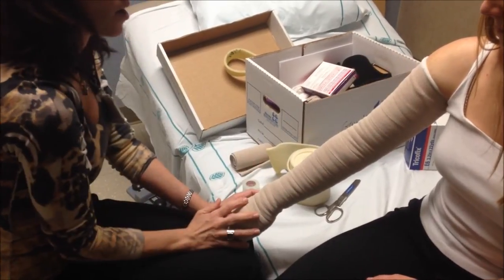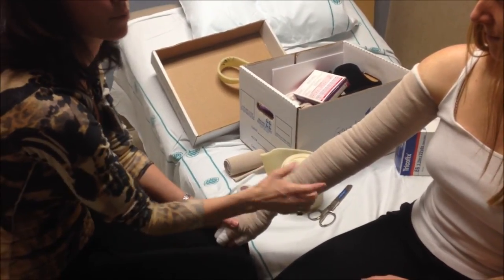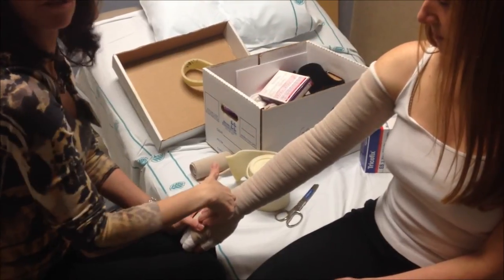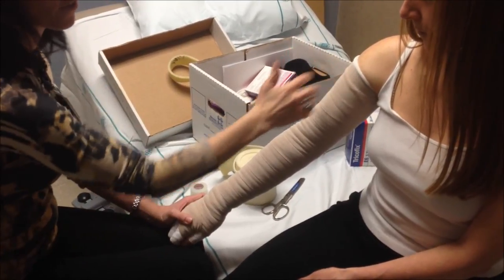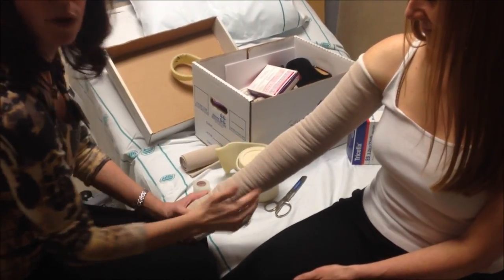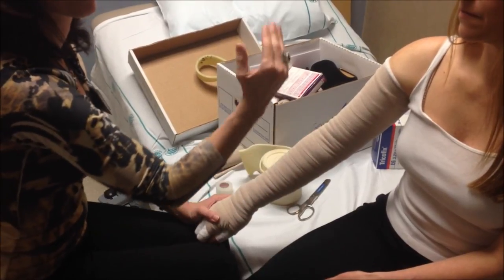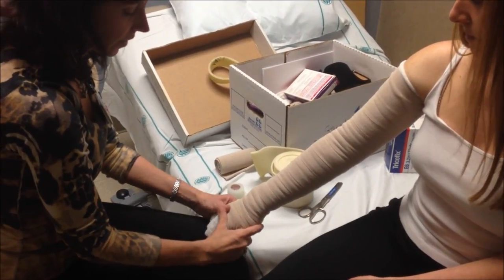If you overlap the same amount all the way up the arm and pull with the same amount of pressure as you go around, you'll automatically make it tighter distally and less compressed proximally by the Law of Laplace — with the conical shape, smaller circumference here means tighter pressure, less here. Another way of achieving gradient pressure: she technically has three layers of bandages distally and two proximally, so she automatically has greater pressure distally than proximally. If patients aren't getting high enough up the arm when they self-wrap, it's usually because they overlap too much. If they get to the top with a lot left over, they need to overlap more. If you make the top part too tight you push fluid back downward. That amount of overlap changes based on fluid reduction — you might start at 50% overlap, but if swelling goes down you may need to overlap more.